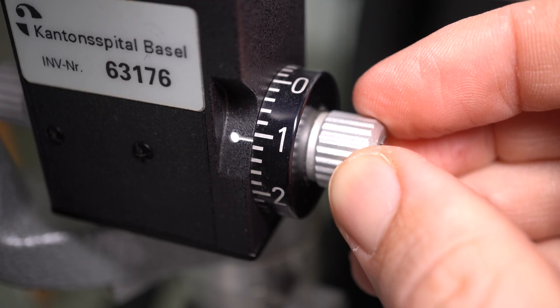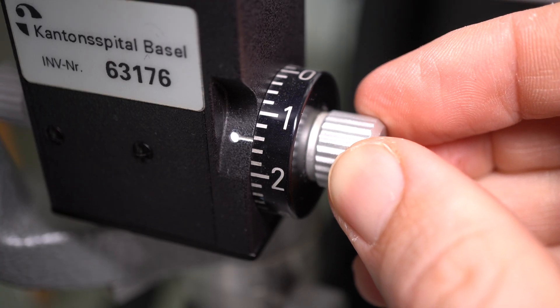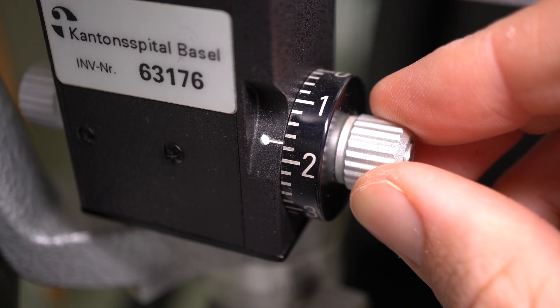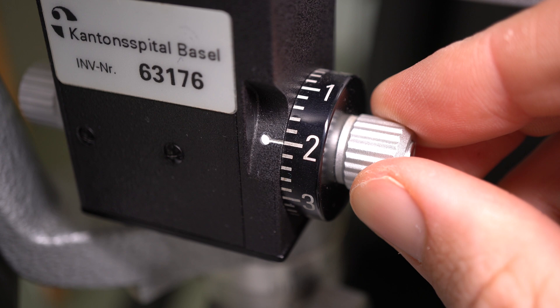Next you have to put in the expected eye pressure. On the side of the device there is a wheel with a lot of numbers on it — this is where you're going to read off the eye pressure that you measured. Before you start measuring, set it to the eye pressure you're expecting. If you have no idea what to expect, put it to around 20.